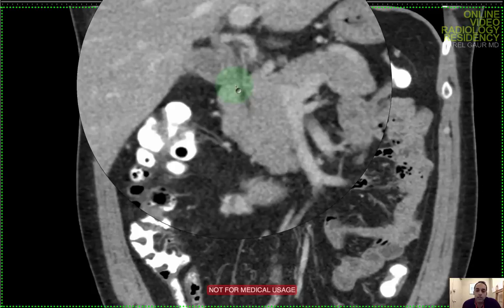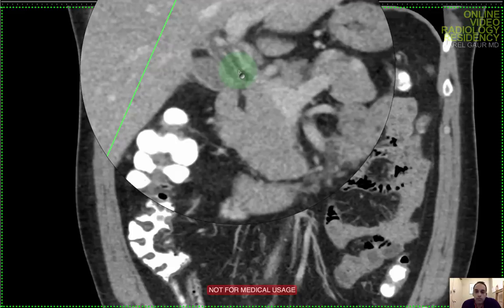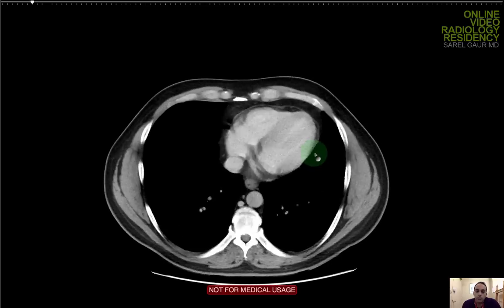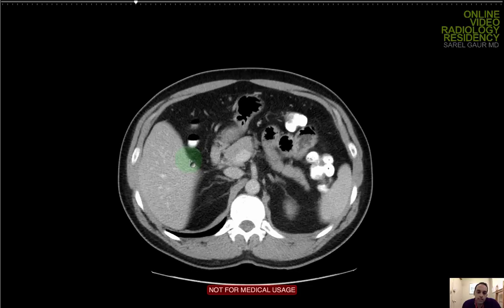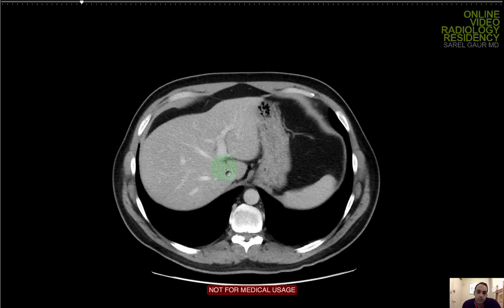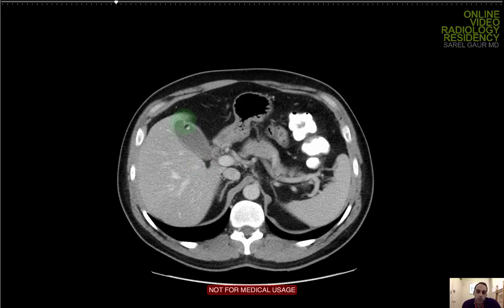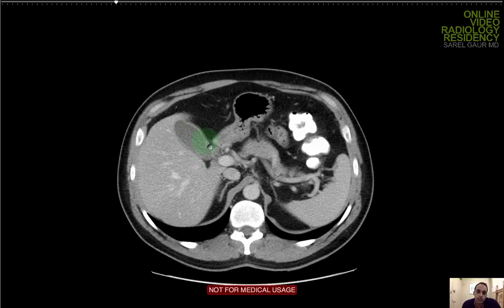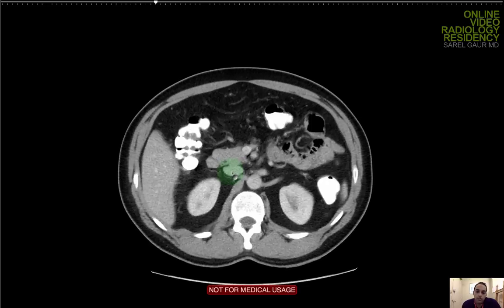While I'm here, I'm looking at the common bile duct, which I can see nicely in this plane — it's not dilated. I can see the portal vein and the hepatic artery. Back on axials: no intrahepatic biliary ductal dilatation — the bile ducts run along the same distribution as the portal vein. Looking at the gallbladder: not enlarged, not hydropic, no stones, no evidence of acute cholecystitis. No intrahepatic or extrahepatic ductal dilatation. No focal liver lesions, no evidence of cirrhosis or other diffuse disease.